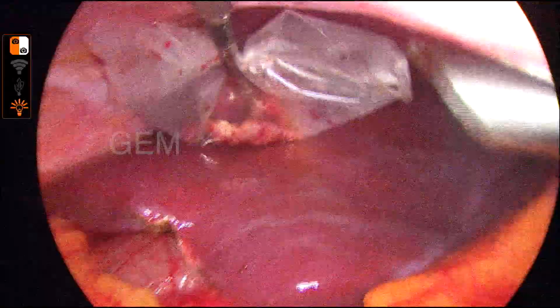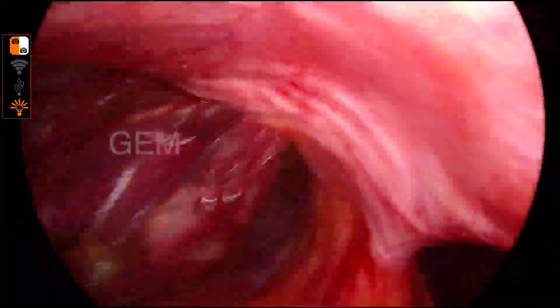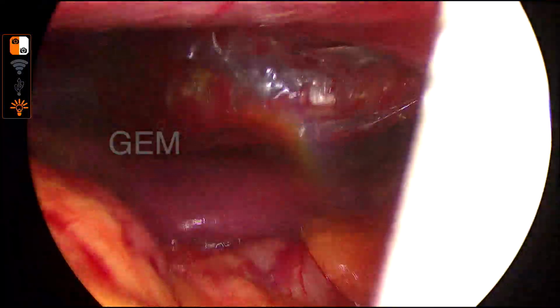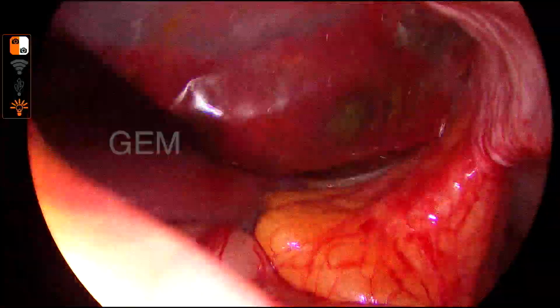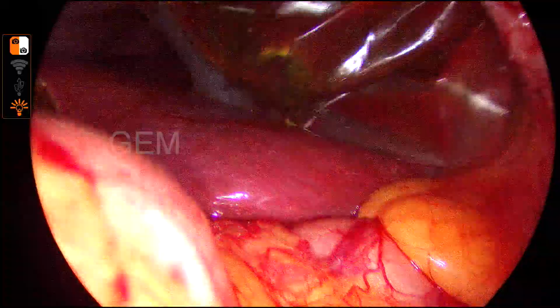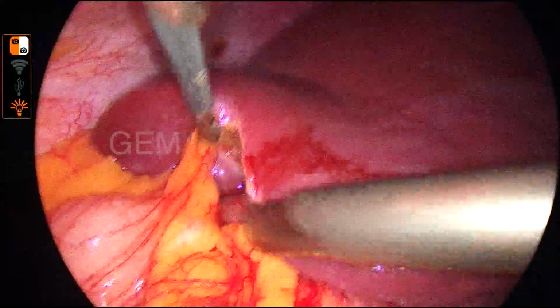I am taking it at the 10 mm trocar, and I introduce the conventional long artery forceps. I take the mouth of the bag outside, and with the sponge holding forceps I take out the piecemeal gallbladder. I am taking out the stone along with the gallbladder bag. The stone can be crushed and then taken out. I don't enlarge the incision in the epigastric region; that 10 mm to 11 mm incision is enough. We can take any size of gallbladder in piecemeal.